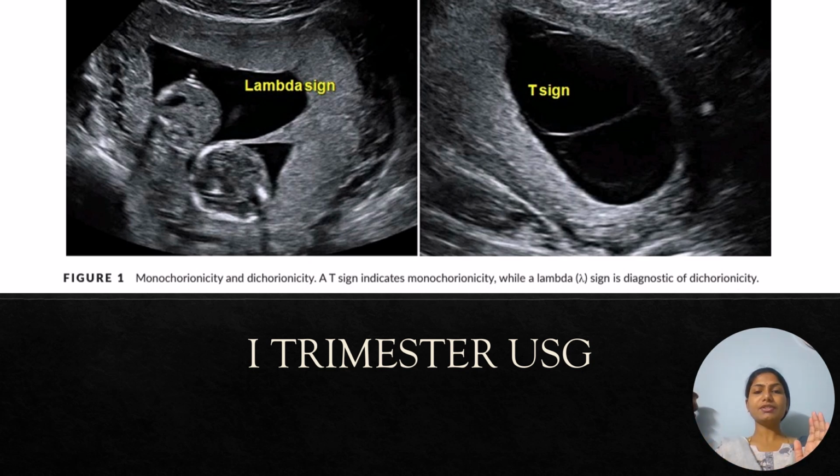We might get confused that it is a twin gestation, but it could be a singleton gestation. So this confusion should not exist. We have to be able to see the two heads in the same frame at a single time. So that is when we define it as a multiple gestation or a twin gestation in a precise manner.